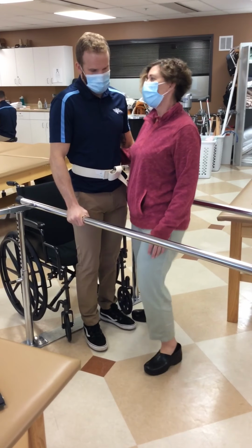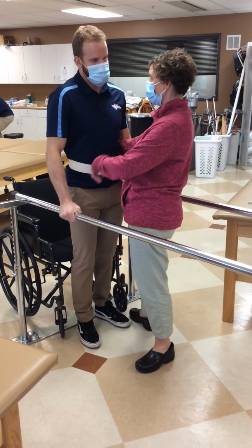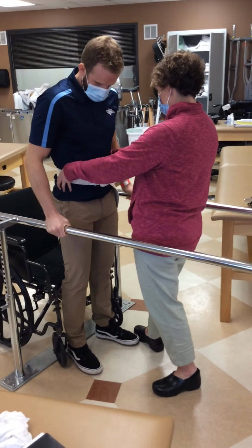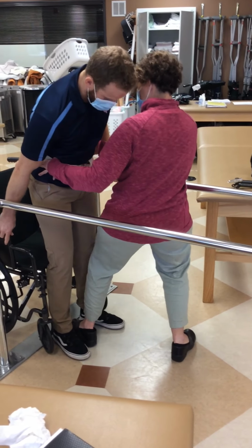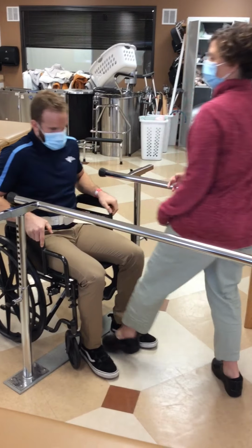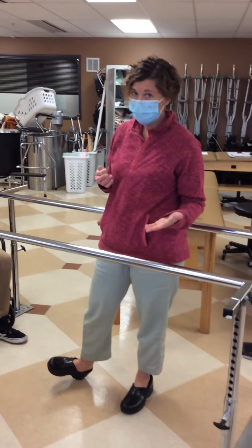Now. All right. When you sit down, I want you to try to keep equal weight on both legs. So you're going to practice that same thing we practiced in sitting. So I want you to reach back with both hands for the chair and lean forward a little bit. And then bend those knees a little bit and start sitting down. Both hands on the chair. There you go. Nice and slow. Well done. Okay. So that would be gait in the parallel bars.